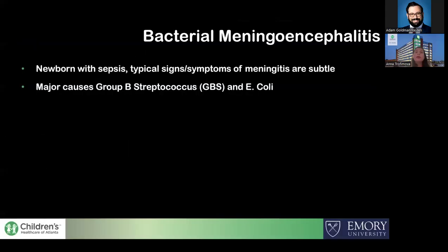Okay, now let's just transition to the discussion of some cases of perinatally acquired infection. We're not going to be talking about congenitally acquired infection, which is another big topic on its own. And here we're just going to discuss a few acute infections that we can see in the neonatal period.